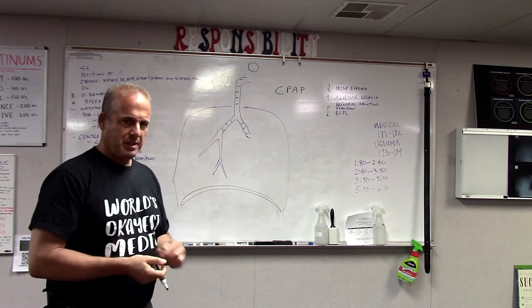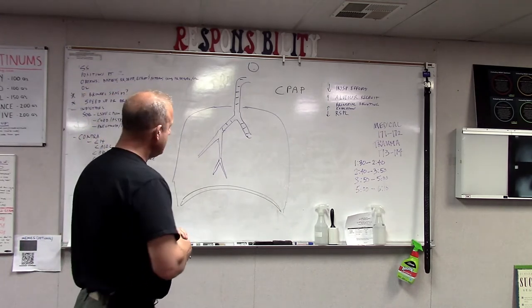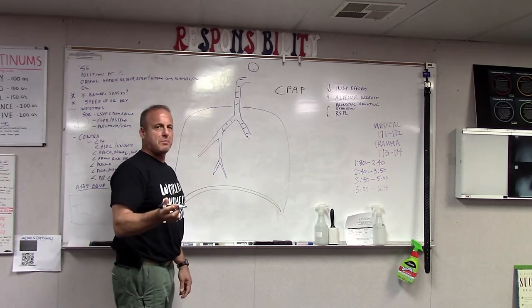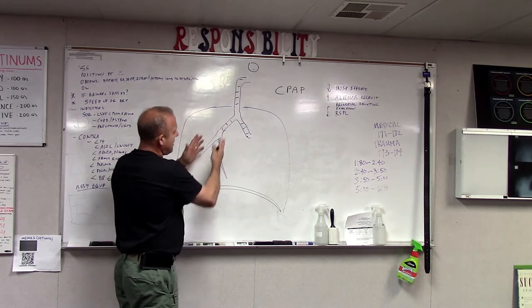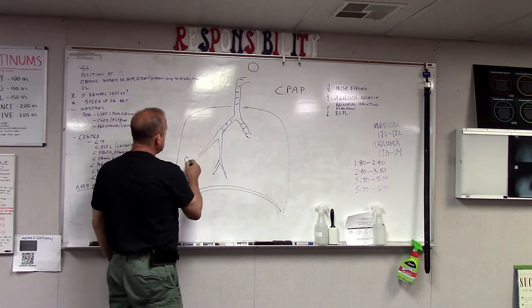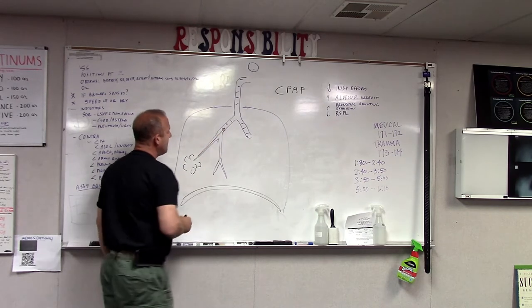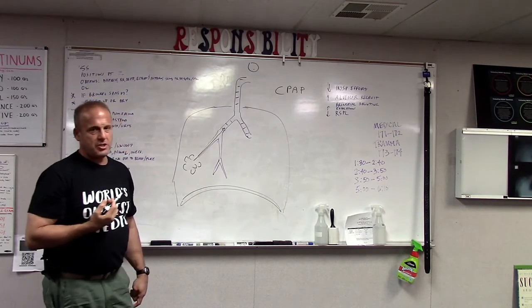But the real magic in emphysema, bronchitis, and in asthma is during exhalation, it creates the effect of a pursed lip breathing. It creates a slight back pressure so that as the person exhales, these airways are splinted open. When these airways are splinted open, the air that's in the alveolar sections is allowed to fully get out. When it gets out, a couple things happen. Gas exchange is improved.